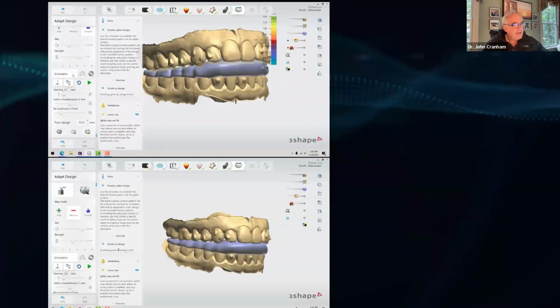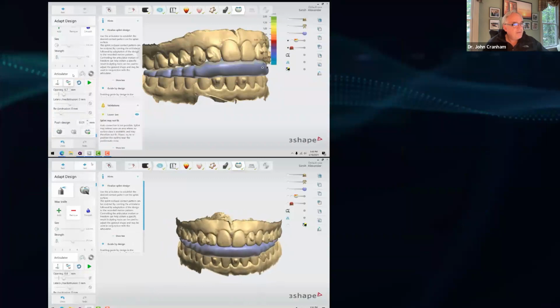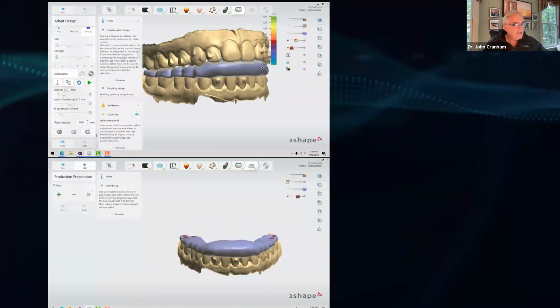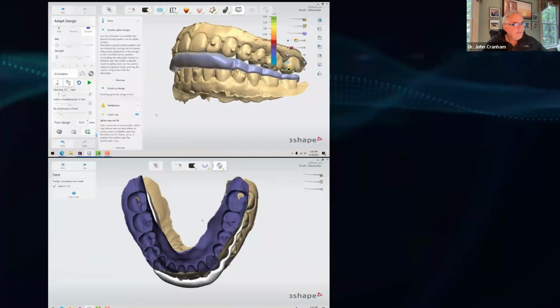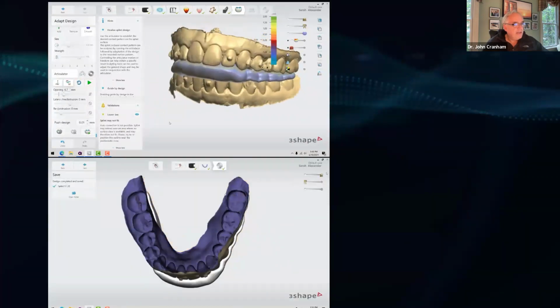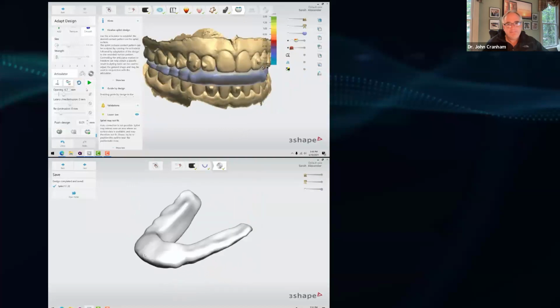And then basically being able to work through all of the different jaw movements in the software is really amazing for us to be able to get the occlusion exactly the way we would want it. Okay, that's a good example of the Tanner type software. And then ultimately printing it, getting an STL that we can go ahead and just print.